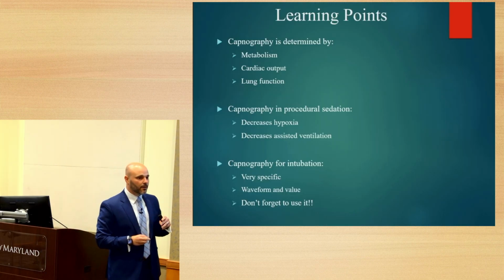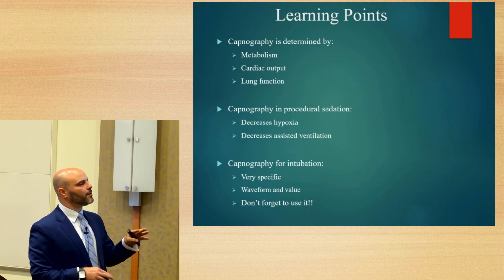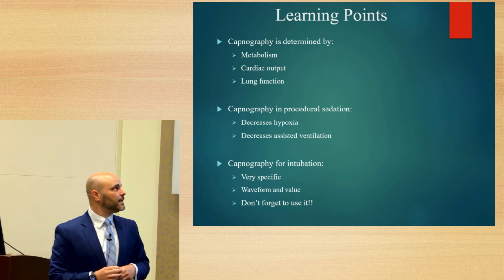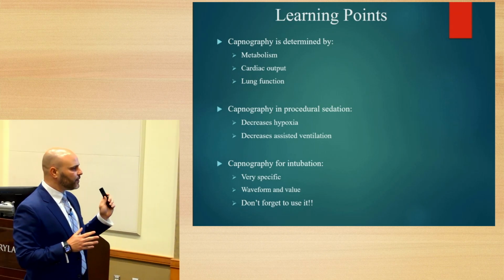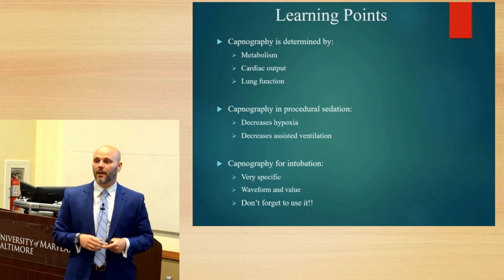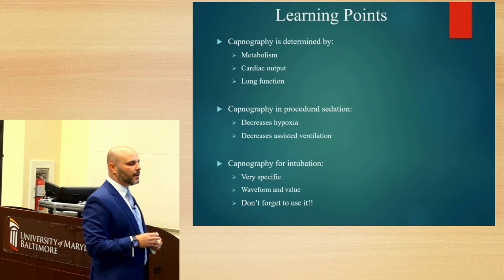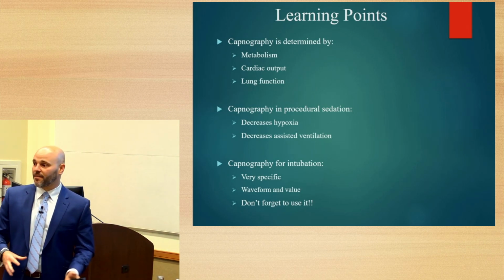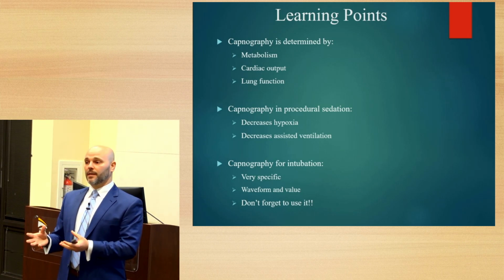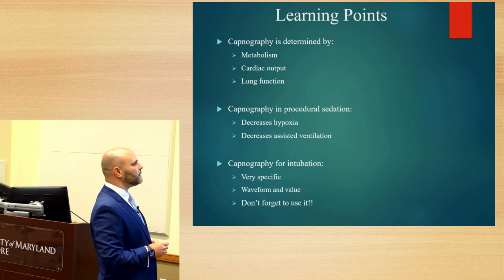I like to get my learning points up front. There's a lot here, but I'm hoping to convince you of and show you some literature as to some of the important points. We're going to start off the talk with a little bit of physiology and how capnography is determined by three major factors. We'll go into depth on that and lay the foundation as to how that affects the utilization and usefulness of capnography in different patient populations.